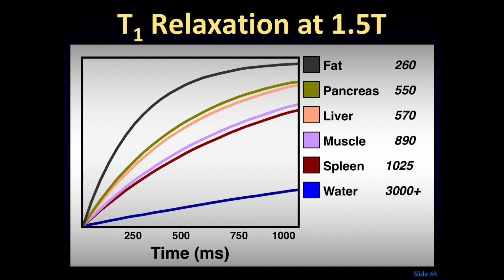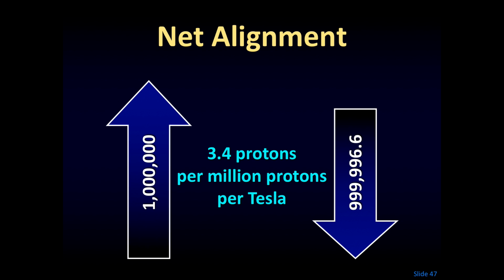The spleen behaves a lot on MRI like a metastasis. So often the spleen is considered a surrogate of a metastasis. So if you substitute metastasis for spleen, you would see the T1 relaxation time that you might expect for your average metastasis.